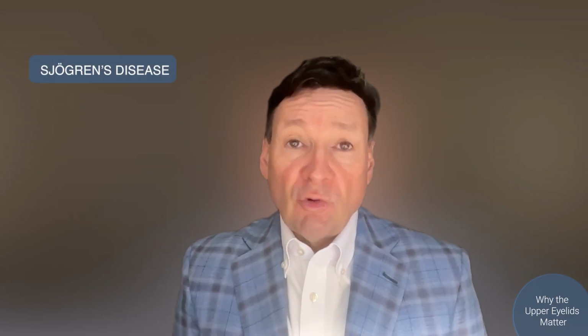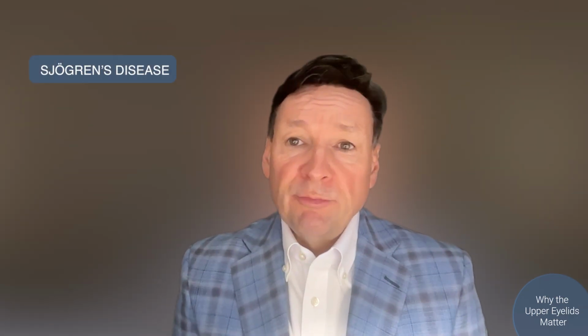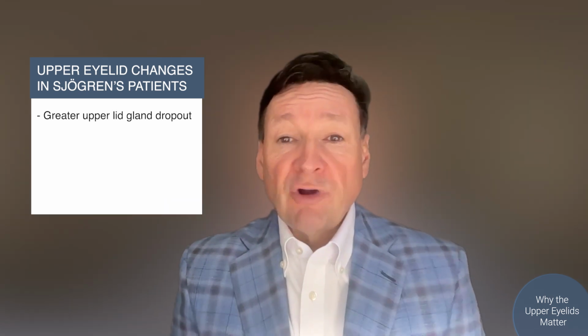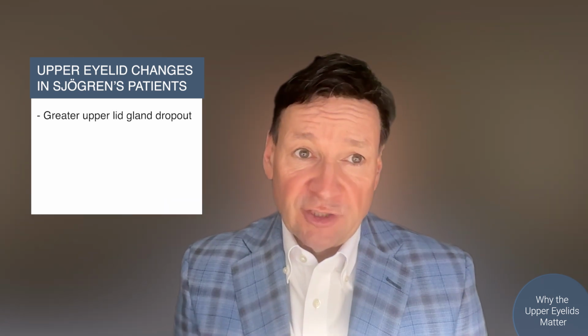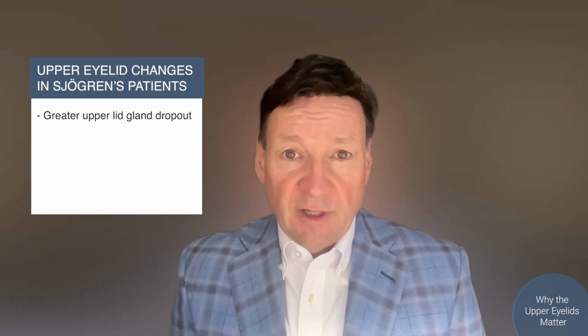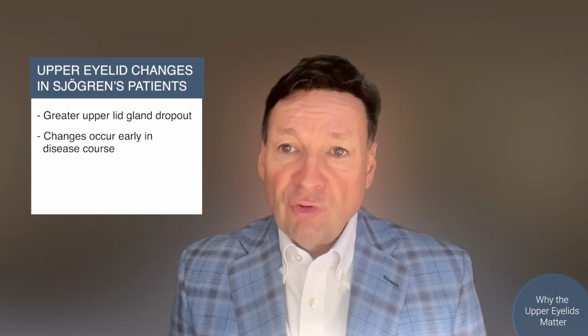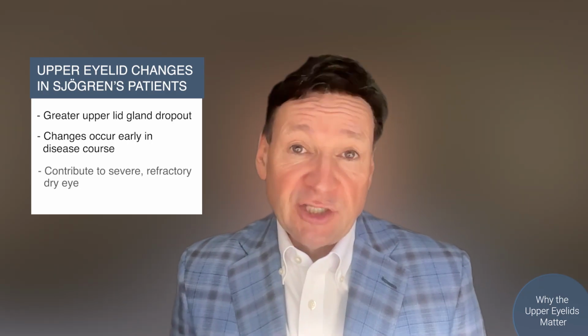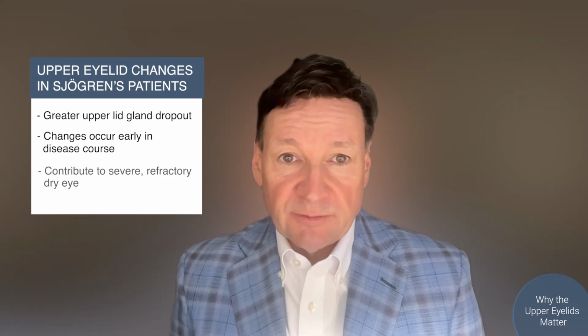Now let's look at Sjogren's disease, a systemic autoimmune disease with profound ocular surface implications. Several studies show that upper eyelid meibomian gland dropout is significantly higher in Sjogren's patients than in non-Sjogren's dry eye. These upper lid changes appear early and likely contribute to the more severe refractory nature of this population. Upper lid meibography has become an important component of my Sjogren's screening algorithm.